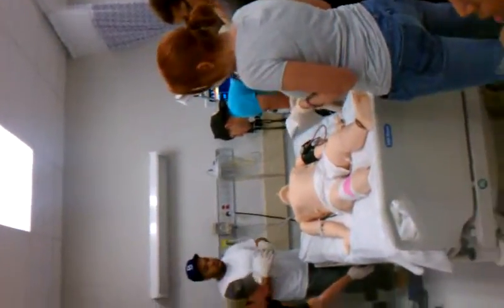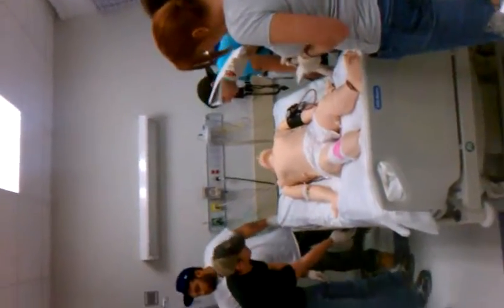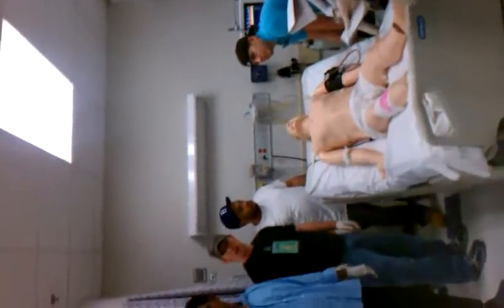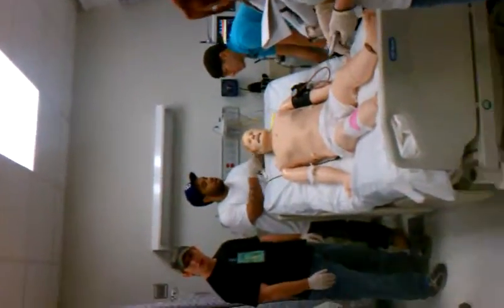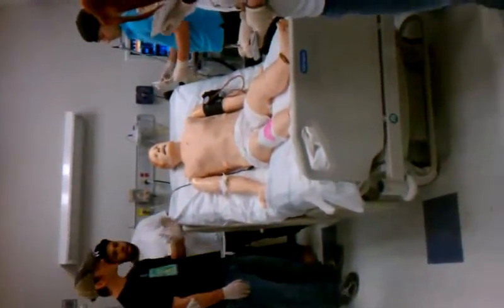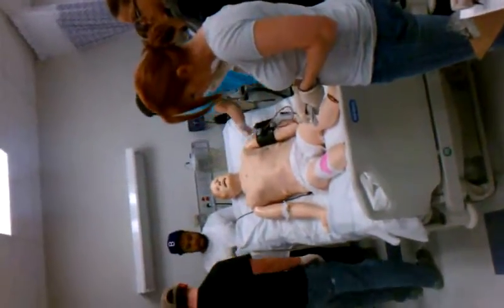All right. Now we're going to put him on a, yeah, you can set him up. And we would put him on a cool mist. I didn't bring one in. I forgot about that, I'm sorry, but we put him on a cool mist aerosol. Is it a simple mask with cool mist, or what does it look like? No, the aerosol mask with the corrugated tubing and a nebulizer. Okay, and you set the nebulizer at 35%. I'm sorry, I should have had that in here.